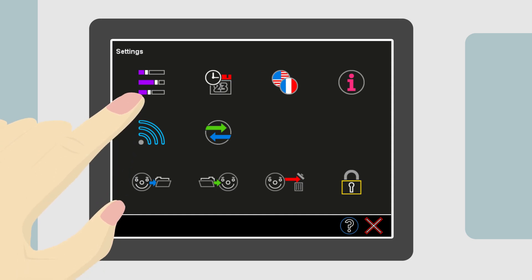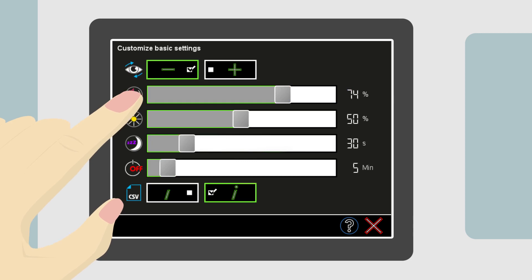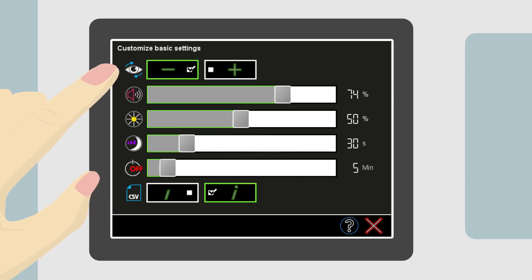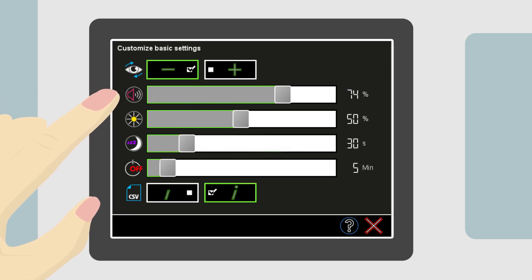This is used to adjust the device operating settings like screensaver and automatic shut-off timers. The top line is the cylinder value. Usually, this is left on the minus sign. Next is the volume of the warble sound.